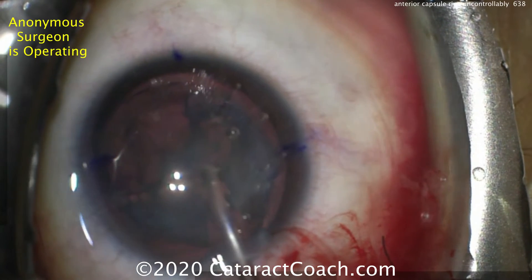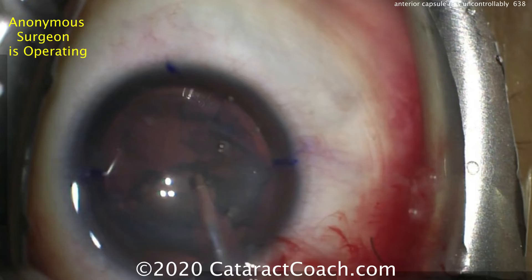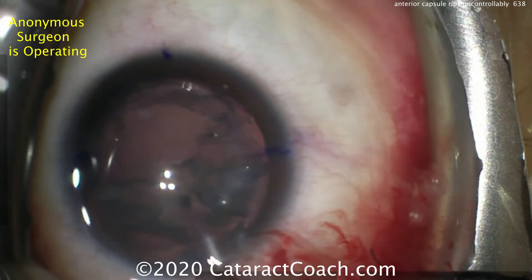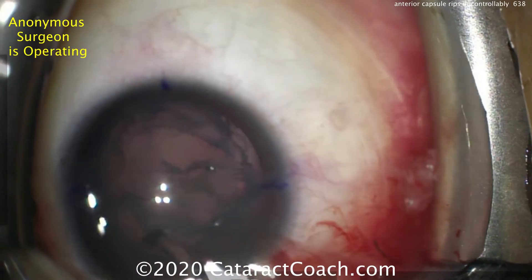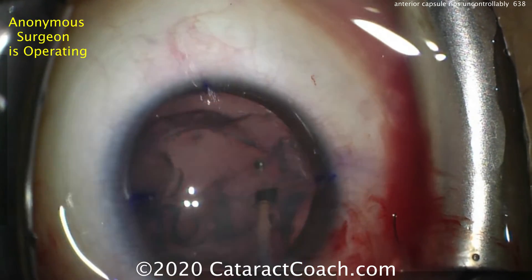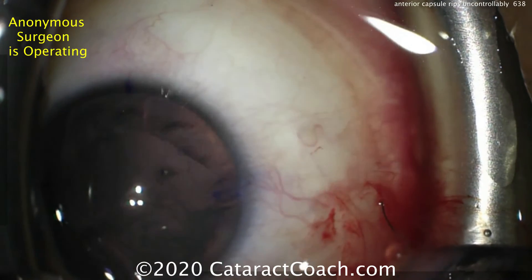So the technique now: the surgeon is going to place the phaco probe in the eye and just very gently aspirate out this relatively soft lens, being very careful not to induce any further damage to the capsule. Now, further complicating things is that this patient was to get a multifocal toric IOL. So just removing the lens material here, we're going to see in a moment just how ripped the capsule is.